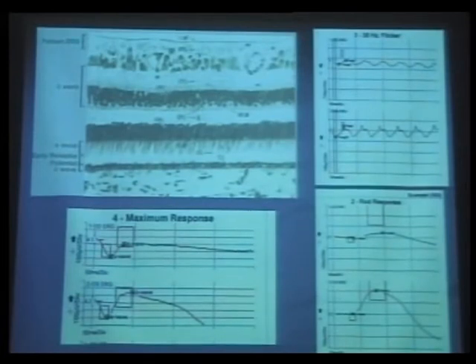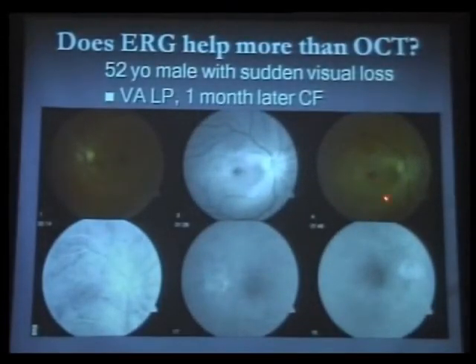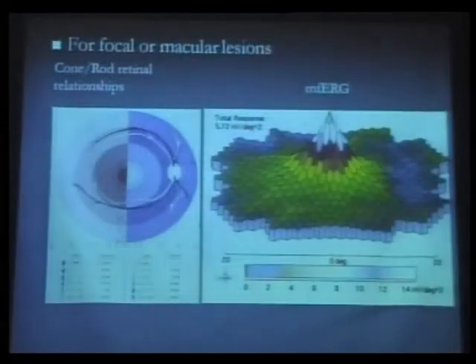So what that told us is that the key here was not the degree of retinal involvement that he had, but the degree of optic nerve involvement that limited his recovery. And so he had an ophthalmic artery component to this with a choroidal ischemia, and that limited his recovery. But the ERG told us that we were successful in helping the retinal perfusion part.